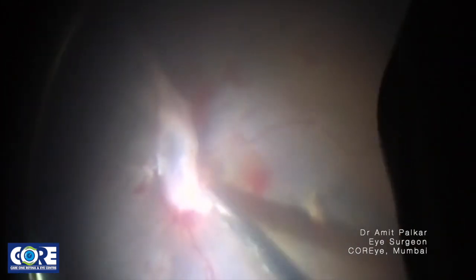The bevel is towards the retina, the sharp edge is towards the membrane. Eating up the separated membrane again with the cutter.